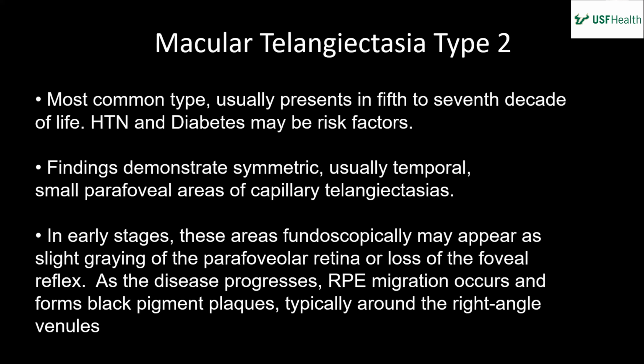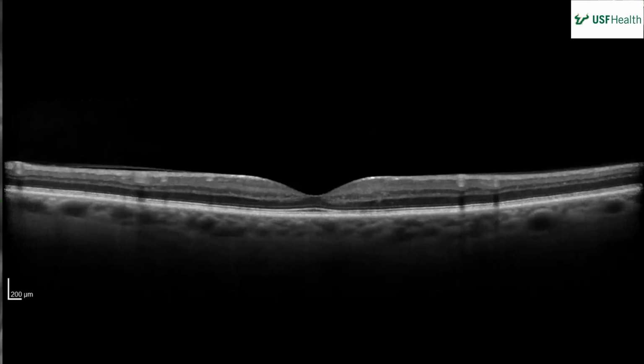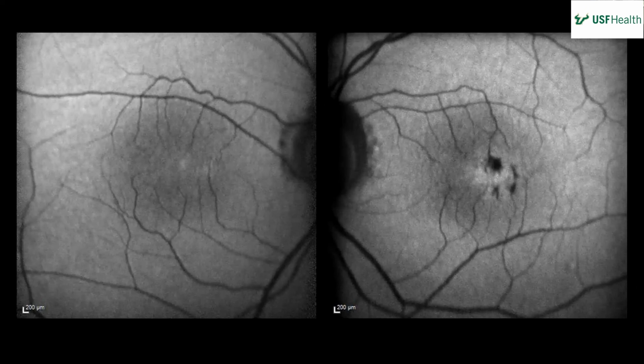And then one of the things that the book and a lot of resources say is that there's a lot about right angle venules, especially on FA. I didn't feel like that was super apparent in these images, but that's one of the things that a lot of stuff online seems to think is relevant. Hop back real quick, hold on. The right angle venules are a little bit confusing because it's not actually a right angle. The right angle they're describing is where it dives into the retina. So it's not like you see this and then a dog leg. You see where this one truncates? Mm-hmm. You got a venule there that just kind of stops.